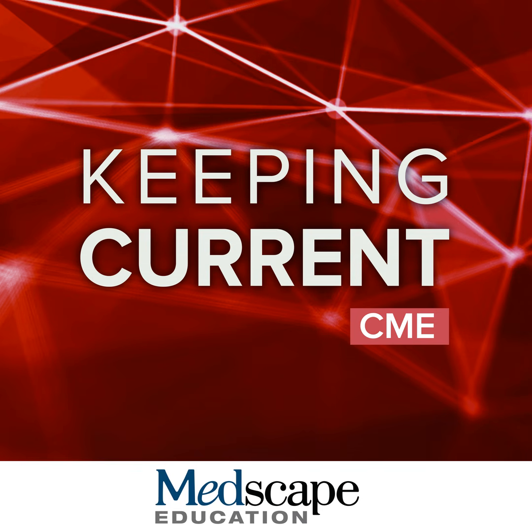Amyloid PET, on the other hand, provides us information about not only how much pathology there is, but where it is in the brain. And what we now have, and this is an update that has happened in the last year, is that the visual reads are now approved in the US from the FDA for quantification as well, which is very, very important because this is how it was used in clinical trials for these new Alzheimer therapies.